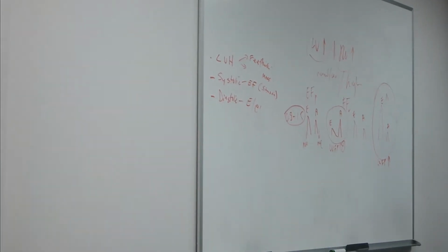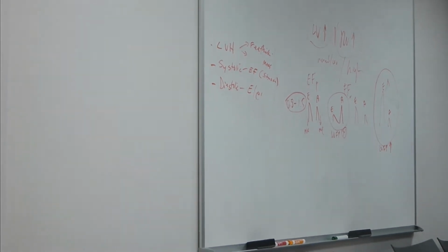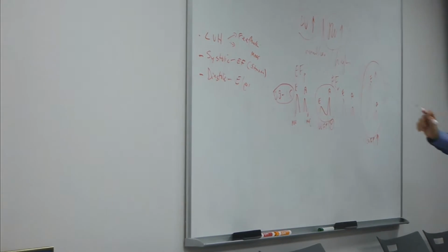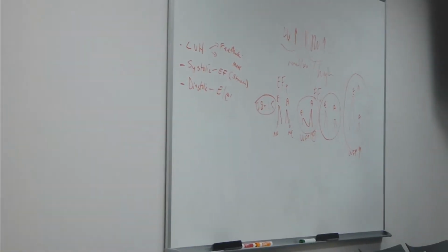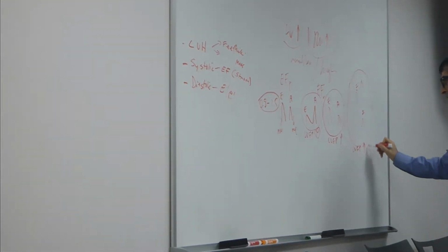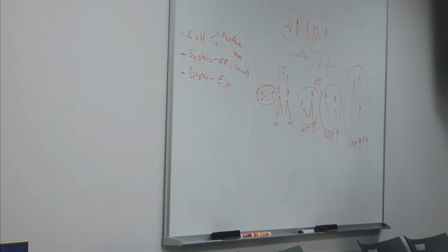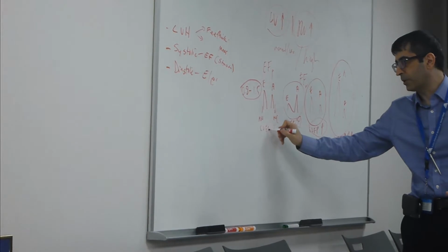Now, we are stuck with these two, which is the normal and pseudo-normal, right? So the problem is that once you transition from relaxation to restricted filling, you have this intermediate zone, which is the pseudo-normal filling pattern, which can mimic your normal filling pattern. But it still indicates that your filling pressures are high. So your filling pressures are high. Here we'll say they're very high. Here they're high, and here they're normal, right? And of course, if you're normal, then your filling pressures are always normal.